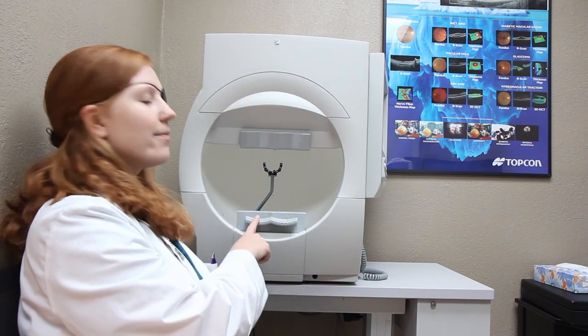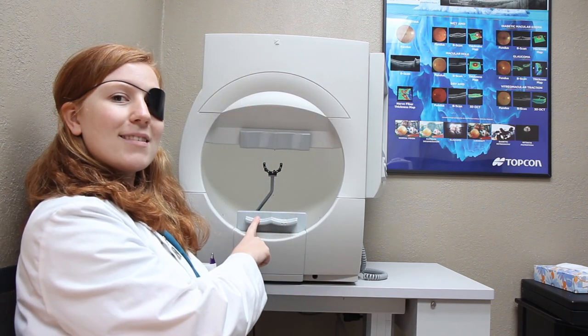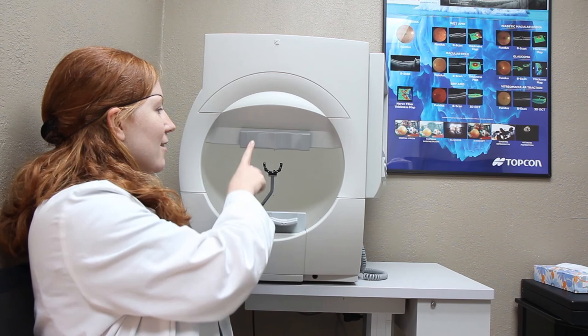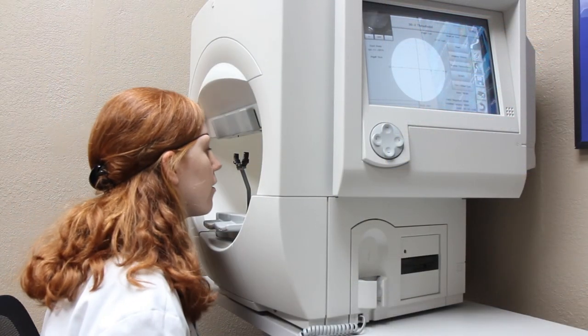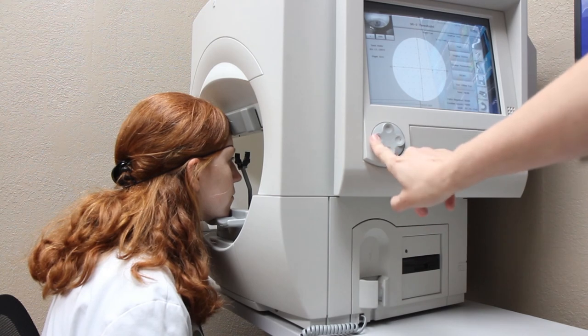Put your chin in the middle of the left chin rest to start testing your right eye. Put your forehead against the bar. Ask the technician to raise or lower the chin rest to make it more comfortable.